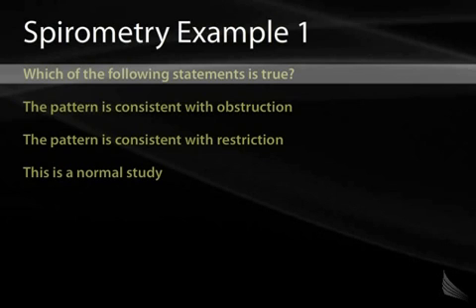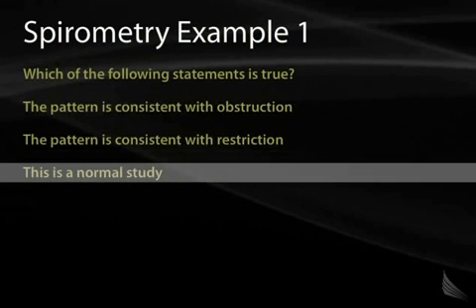Is this pattern consistent with restriction? We see normal forced vital capacity. We even see normal lung volumes. So no, this is not consistent with restriction. This is actually a normal study.